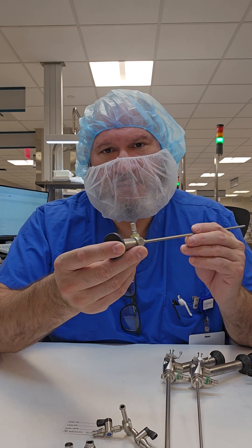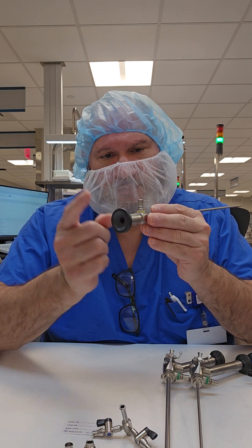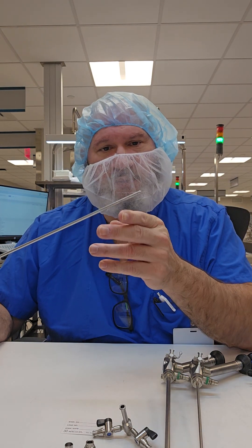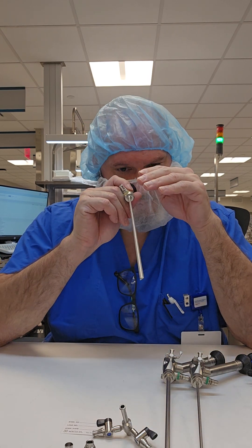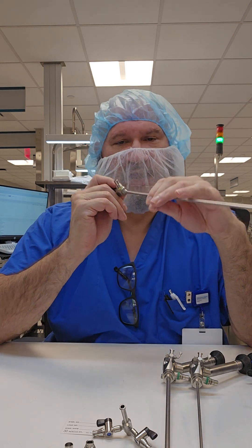Just a quick anatomy overview: this is your eyepiece for your endoscope, you have your light post, you have your shaft, and then you have your viewing angle. Your viewing angle is the cut that determines where the scope looks when you're looking through the eyepiece or camera.